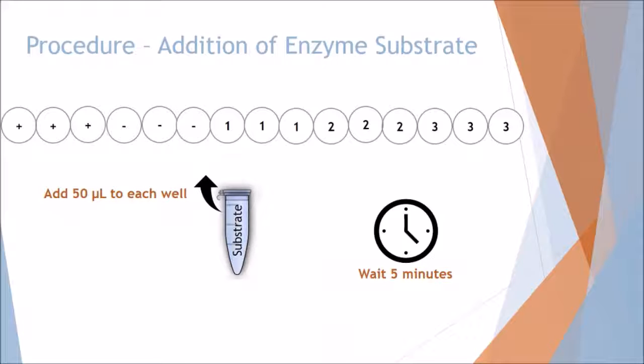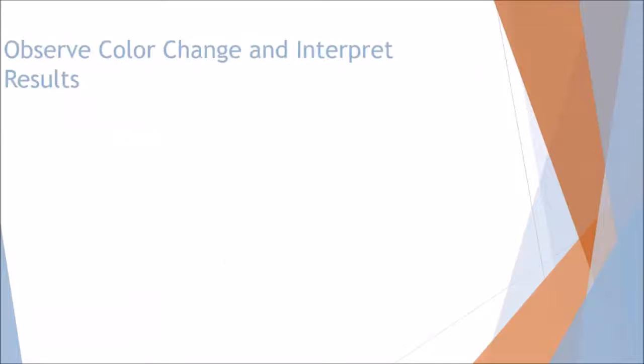And last but not least, we add our enzyme substrate, and we'll be adding 50 microliters to each of the wells. The incubation time is 5 minutes, and from there it will be time to read and interpret our results.